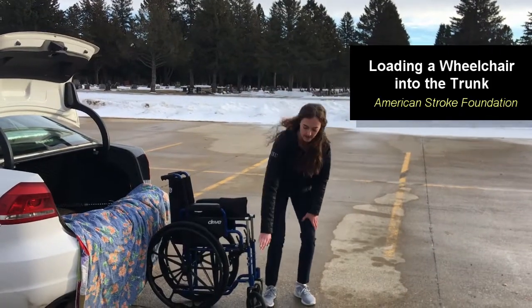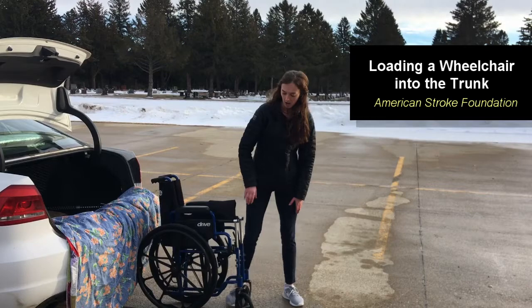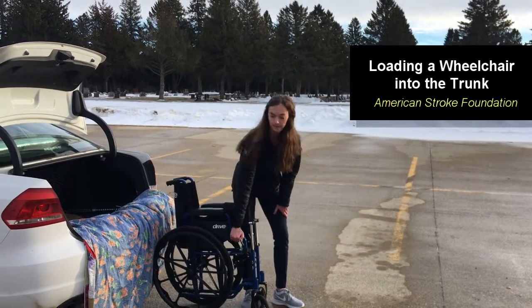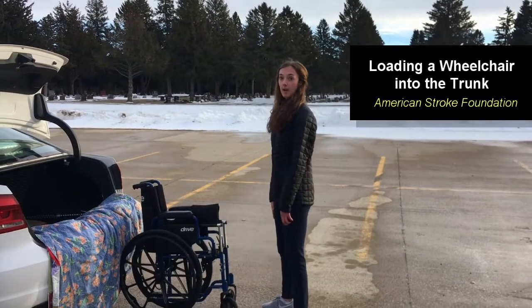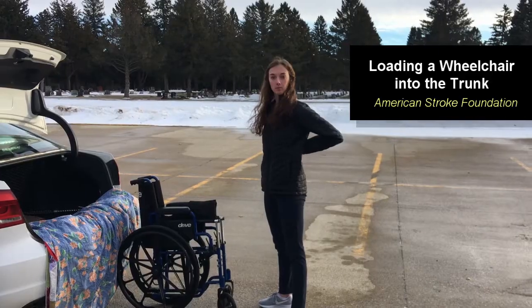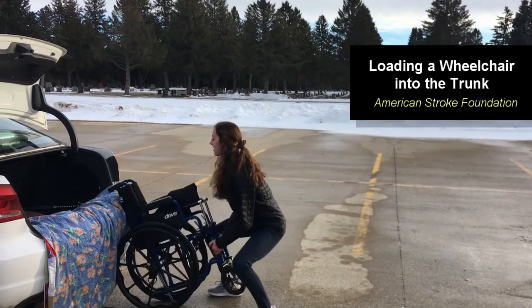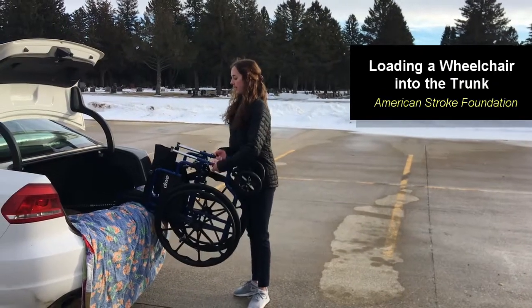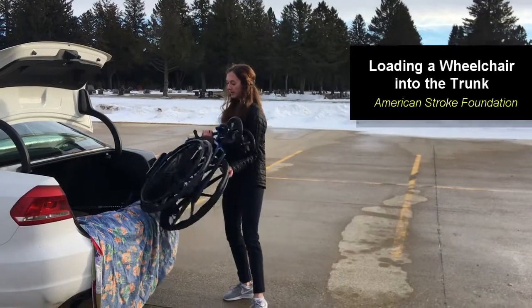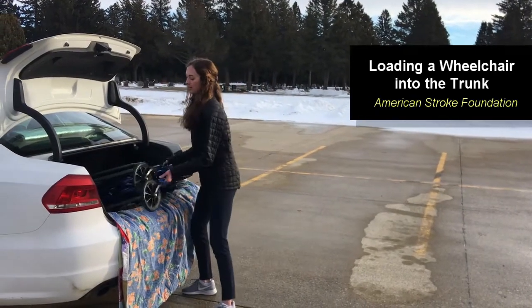Grab down by the wheels — it's important to grab onto the wheels rather than something like the armrest that could accidentally pop off while you're doing the transfer. Next you're going to bend down; make sure to bend with your legs and not crouch with your back to avoid any back injuries. Tilt the wheelchair back into the trunk, then swing the bottom wheels up at an angle and shimmy the wheelchair in.